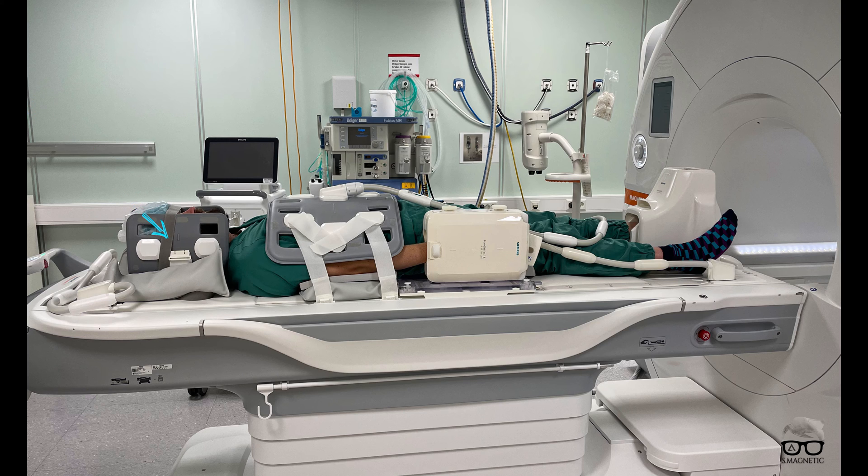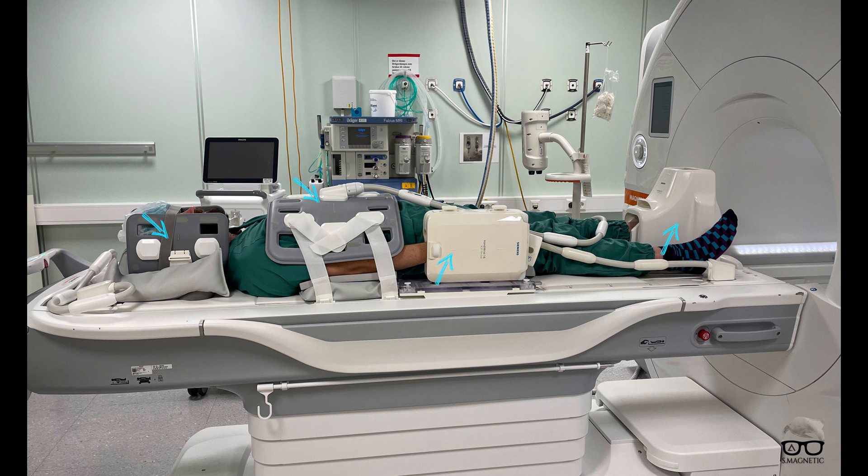So recently we just had a case where we had multiple examinations at once and the radiologist wanted contrast agent. I was thinking, can we do a combination without moving the patient or giving the patient a new time, coming back and forth? So we connected a lot of coils all together and I just had to try it out on my colleague. Today we're going to try to scan TMJ, liver, wrist, and also the foot ankle, all together, just one isocenter. Then you can just use iso directly at the scanner without going inside to put the new reference lines. I'm really looking forward to testing this out and showing you the results. Let's go to the scanner.